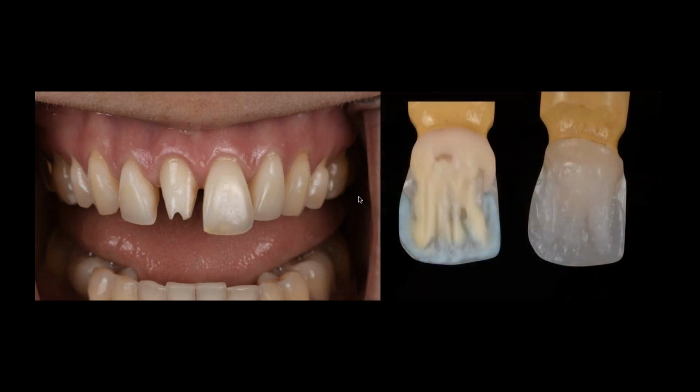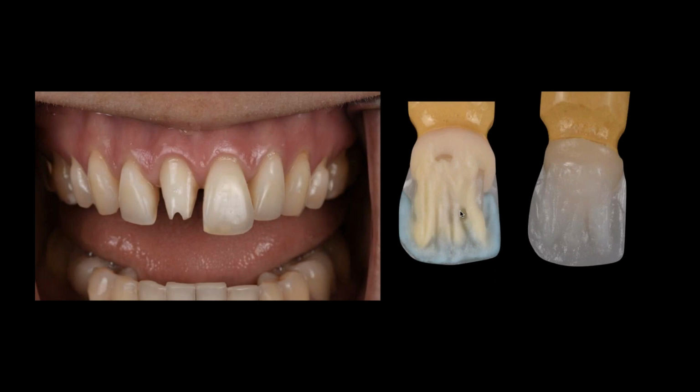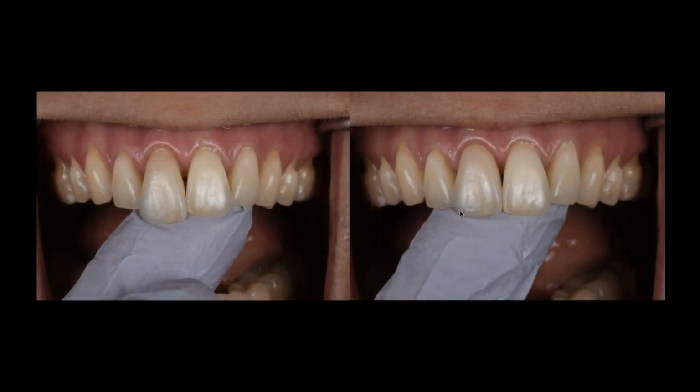I showed this case before, so I'm not going to spend any time on it, except to say that all I'm really doing with very little space to work in is managing my opacity and fluorescence internally. And I actually did that by using margin materials. So I'm actually using very fluorescent margin materials to build up this inner lining or structure. And then after that, it's a simple dentin buildup, very small dentin buildup to achieve the density and opacity that I need to hopefully make this tooth match as well as it can.